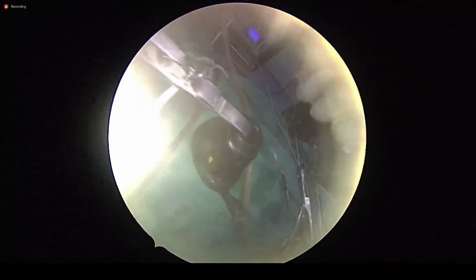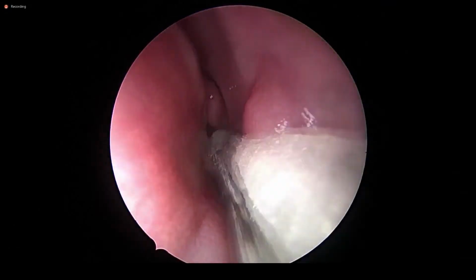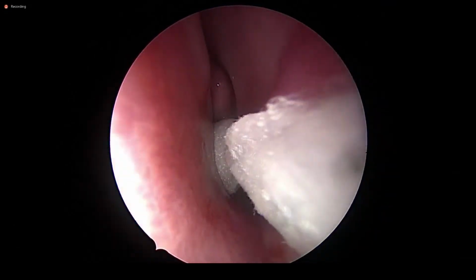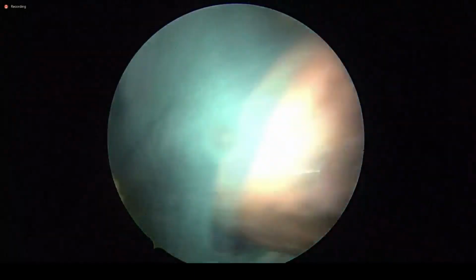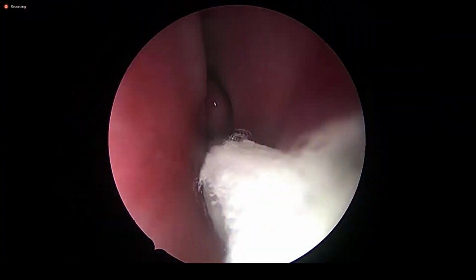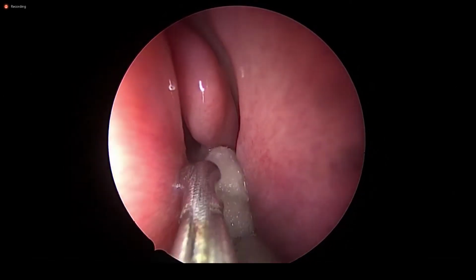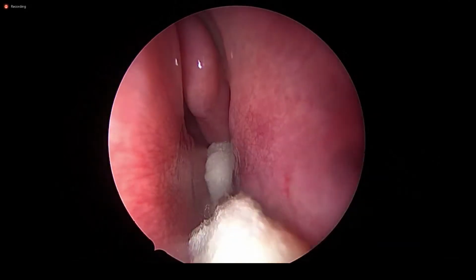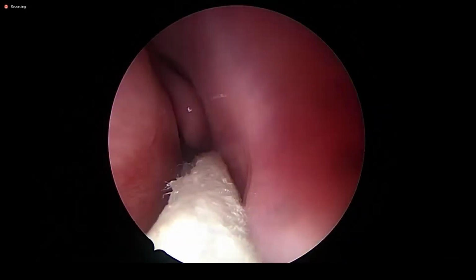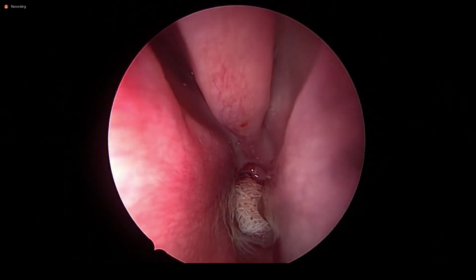If your perimysium and muscles are charred, nasopharyngeal stenosis and cicatrization are imminent afterwards, and those poor children unnecessarily suffer with nasal twang, infection, and a lot of things. In order to prevent that, so far I was avoiding the coagulator. This was my second phase. The third phase is still to come for the laterally hypertrophic adenoid. Any questions?